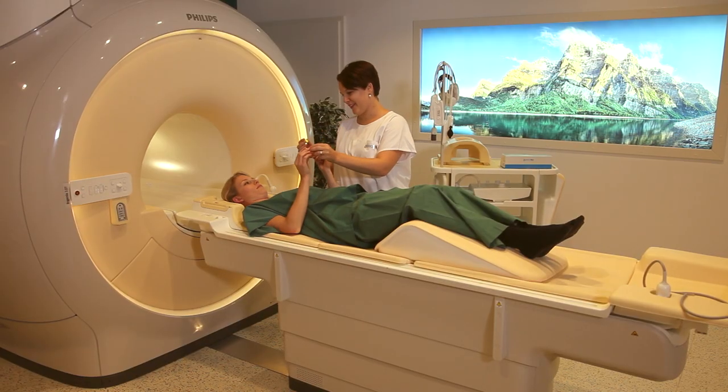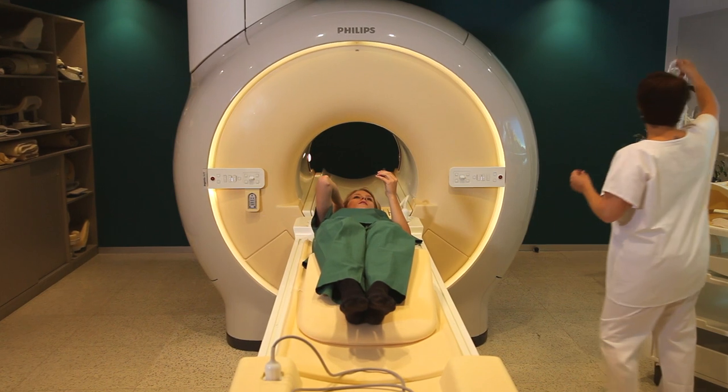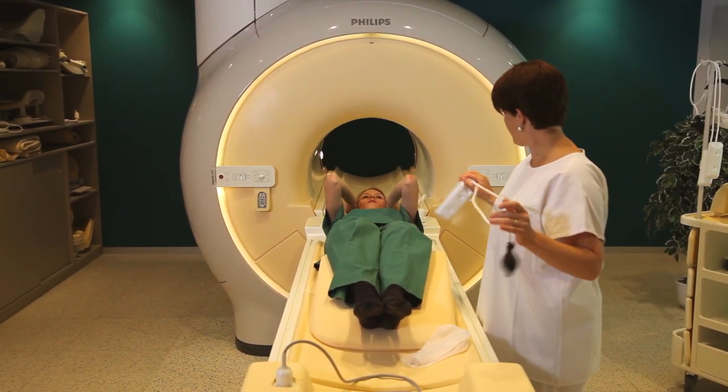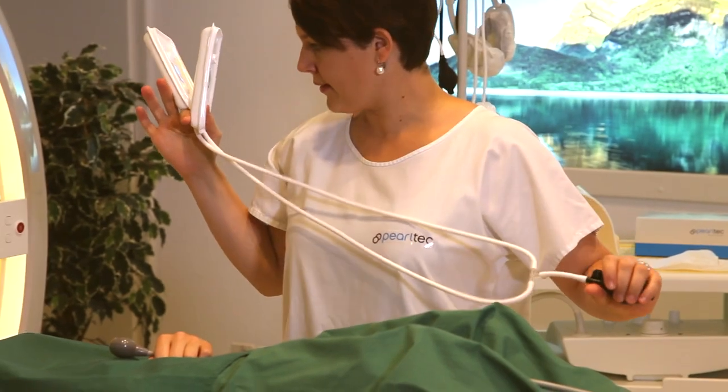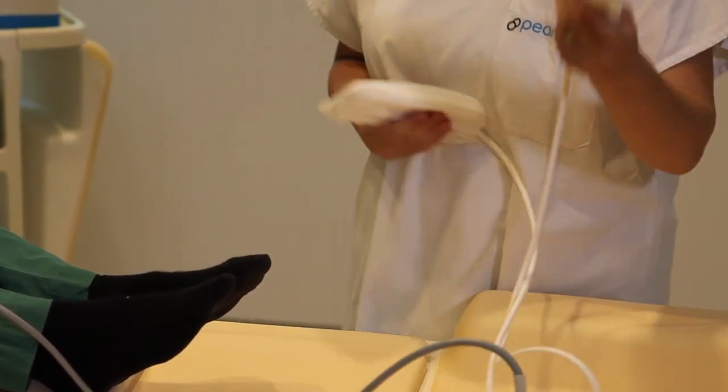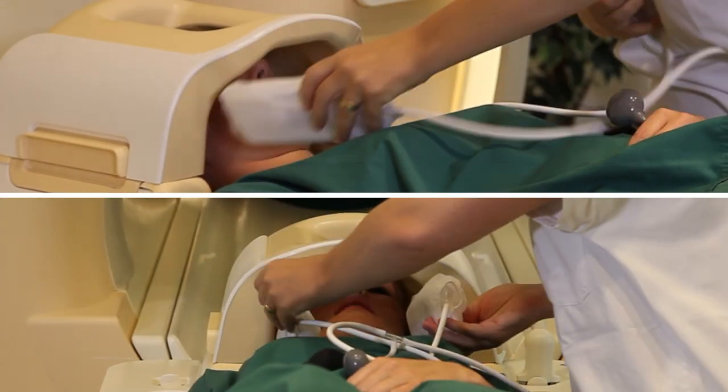Once the patient is on the couch, grab the multi-pad from the rack and start your normal preparations. First, place the single-use covers over the pads. Then place the pads between the patient and the coil, making sure that the pearl side of the pad is facing the patient.